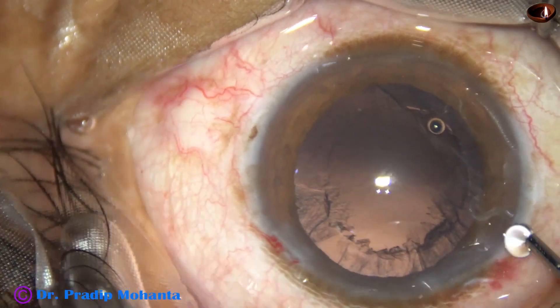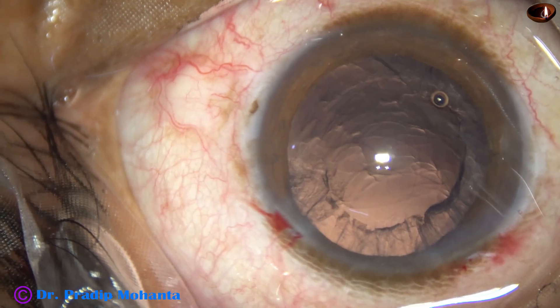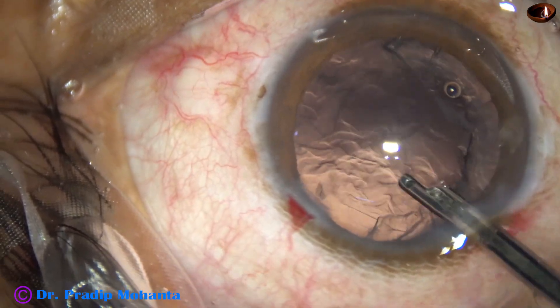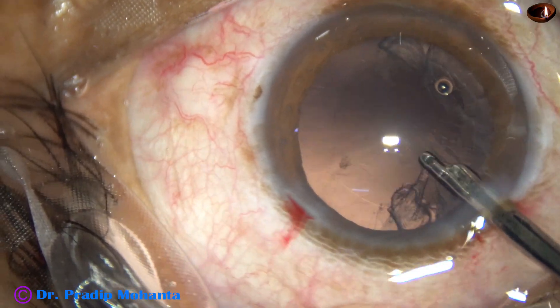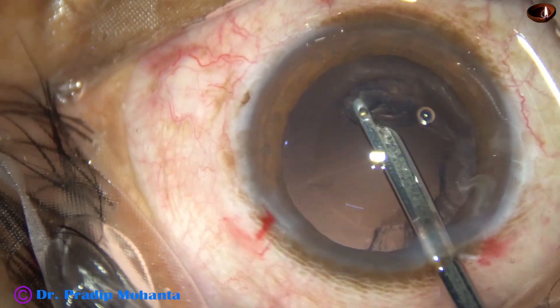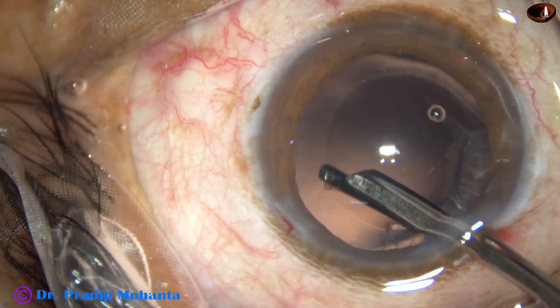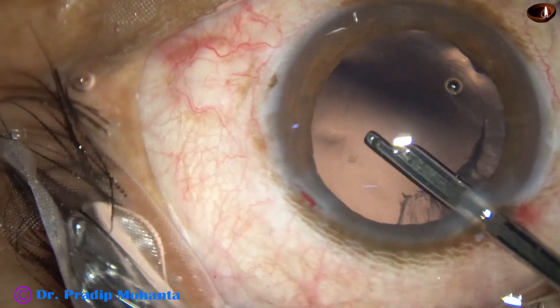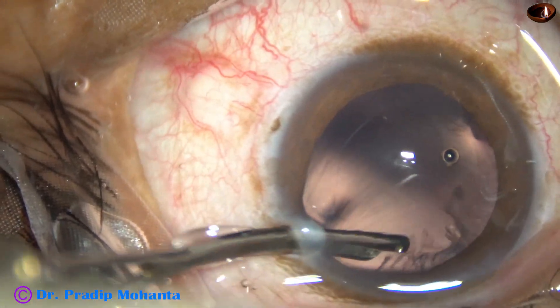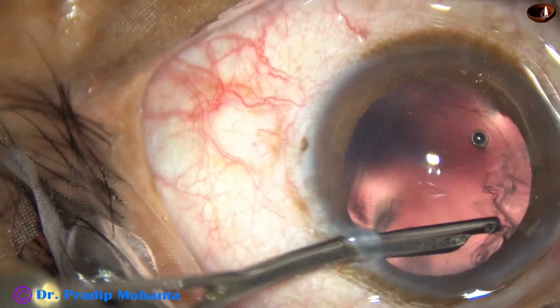The safer instrument is a Simcoe cannula — this is a 23-gauge Simcoe. With the help of this instrument, I am removing the rest of the cortex. There is a small piece of cortex sticking to the posterior capsule. I go through the side port and remove the cortex which is sub-incisional.